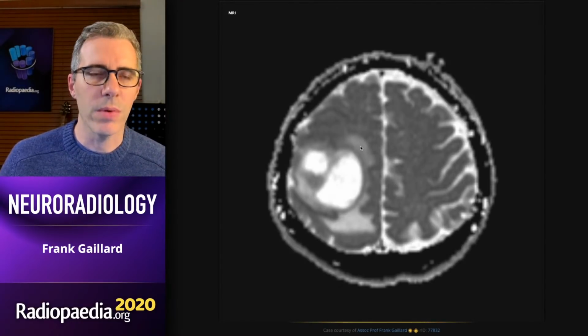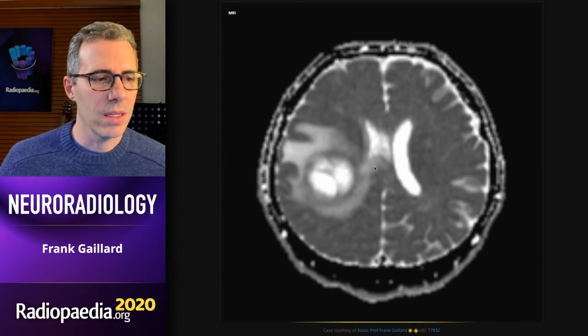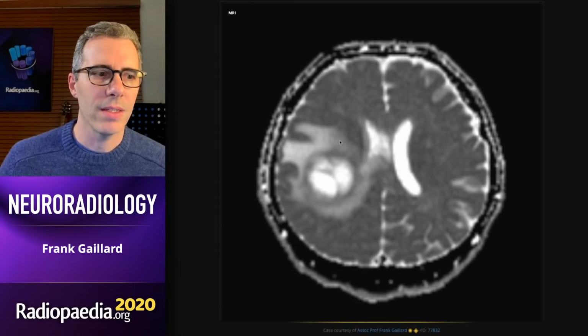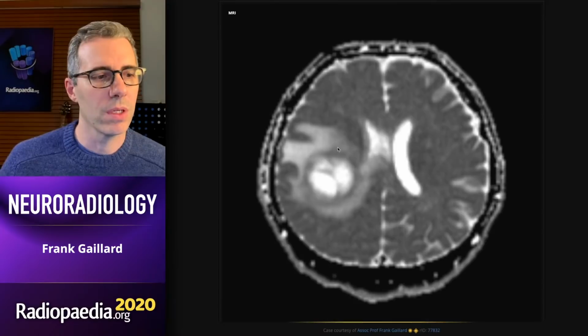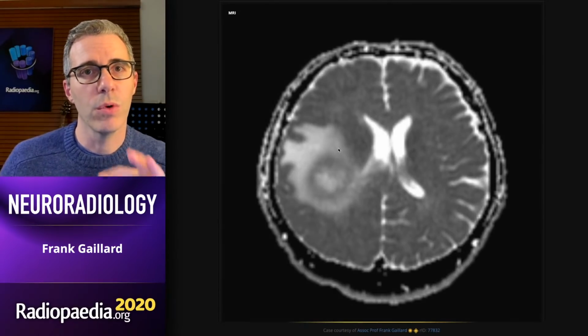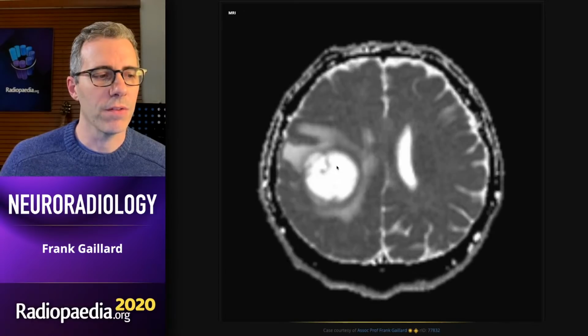Notice how anteriorly, where we didn't have as much edema, the values are lower. And particularly in this component, they're a bit lower. And look at this area here. This area does not look like this area. This tells you that it doesn't have as free a movement of water. And that is probably because there's lots more infiltrating cells through there. And that's particularly the case down here inferiorly.